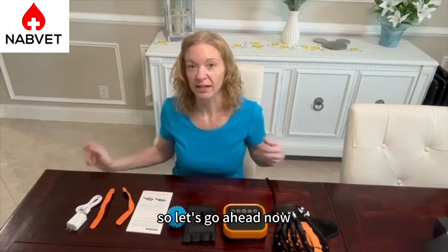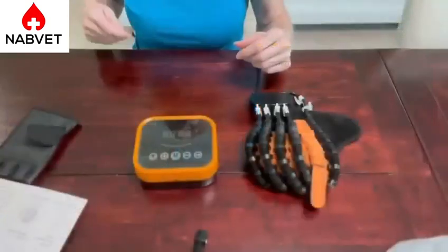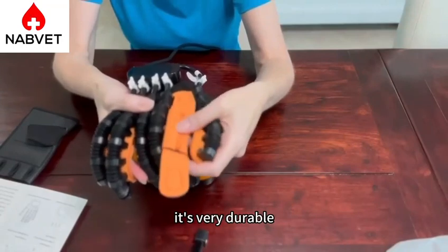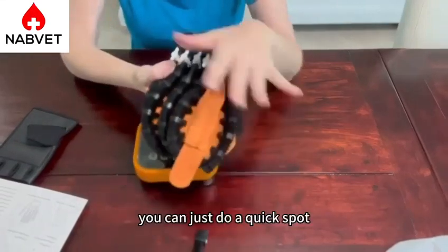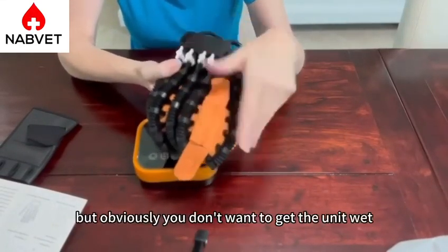Let's go ahead now and take a look at some of the pieces a little bit closer. The first thing we're going to take a look at is the robotic glove itself. It has soft, breathable fabric. It's very durable and it has very strong Velcro on it. It's very comfortable on the skin as well. You can just do a quick spot treatment if it gets dirty, but obviously you don't want to get the unit wet.